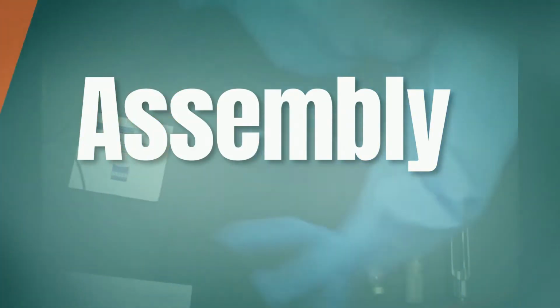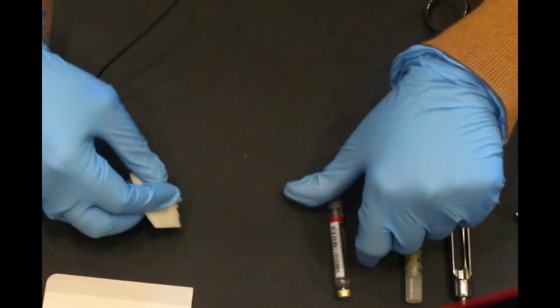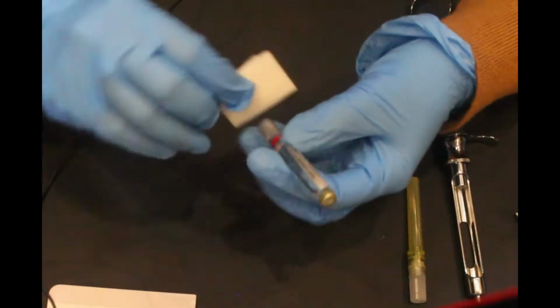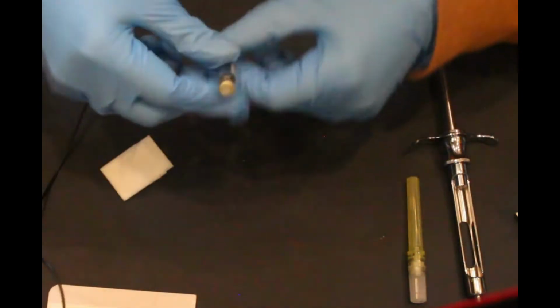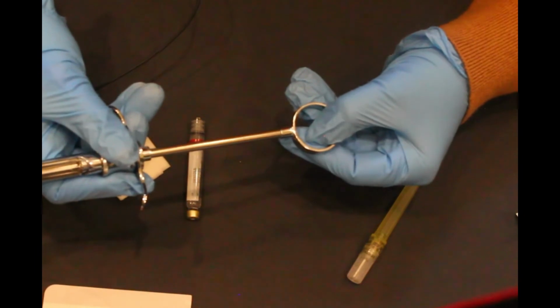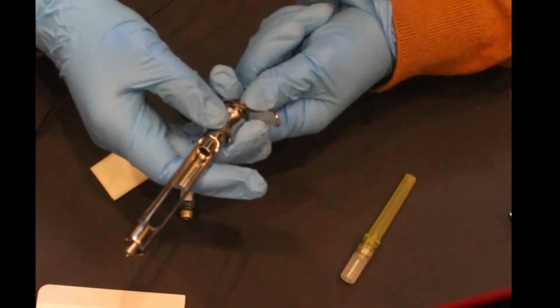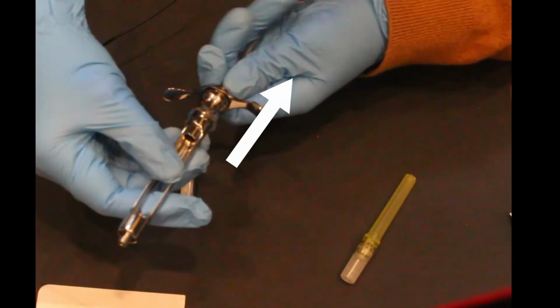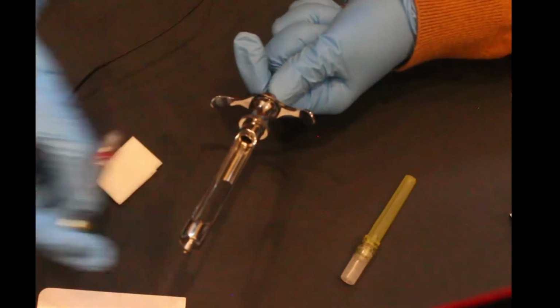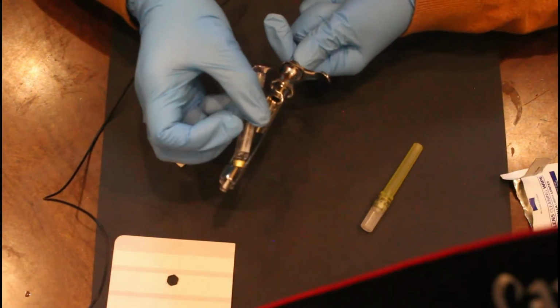First thing we want to do is use an alcohol wipe. Wipe the top and the bottom part of your anesthetic carpule that you want to use in your setup. Now hold the syringe flat on your palm and drag the plunger towards you. In order to do that, use your thumb and the side of your forefinger to hold the syringe firmly. Pull the plunger towards you simultaneously. Then insert the metal part of the anesthetic carpule in first.